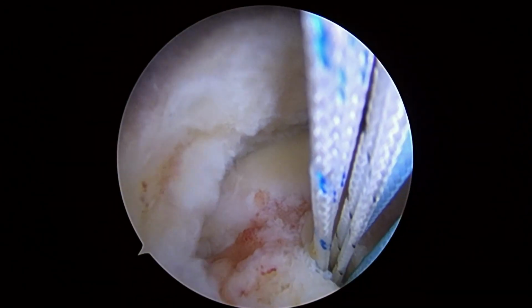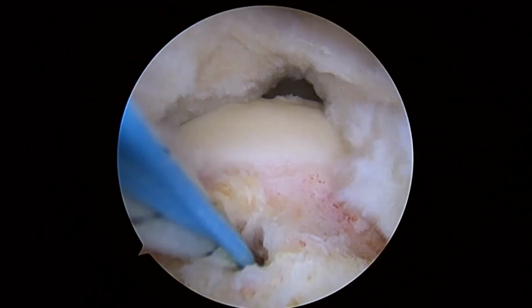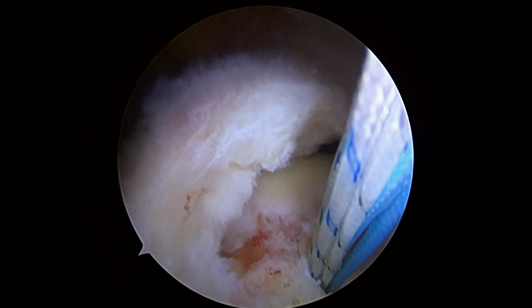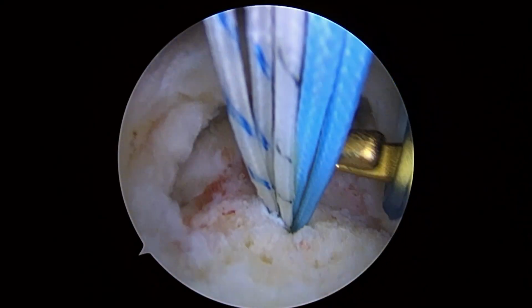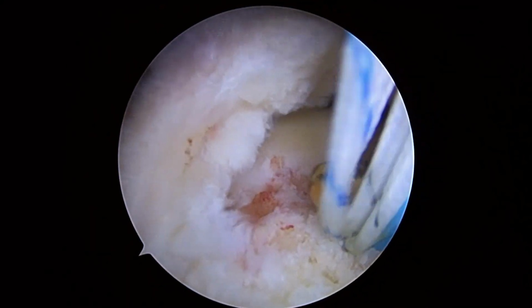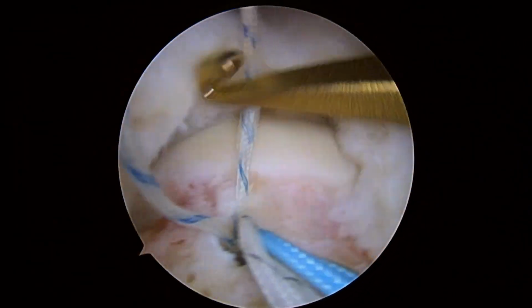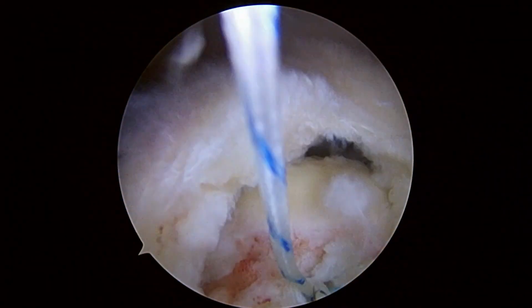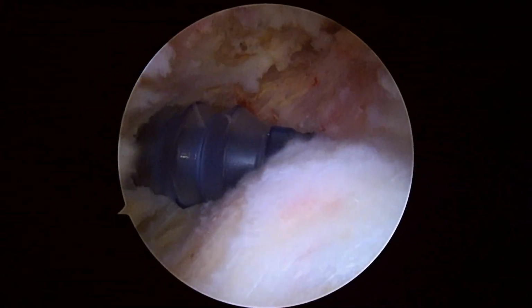And there you can see this particular anchor has 3 sutures. When I pull back on them, it's very tight in the bone there, so we have a good hold. So now we'll go ahead and start moving these sutures around in order to tie them. Looks like we're going to start with this blue and white striped suture first. So we'll take this suture out the front, and then we'll take our straight crescent suture hook and bring that in from the back here.